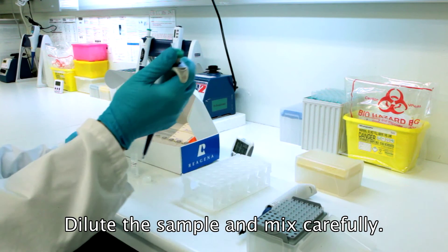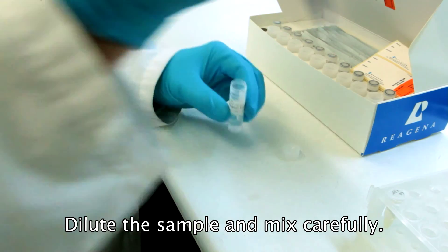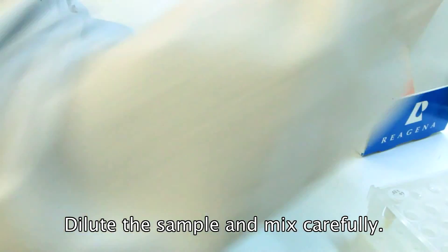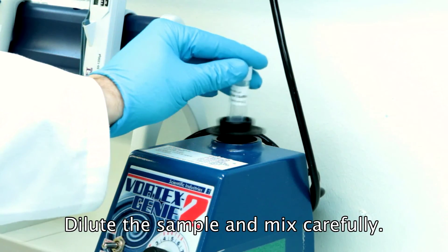Put 5 µl of serum or 20 µl of cerebrospinal fluid into the dilution buffer vial. Close the vial and mix it well by shaking or vortexing.